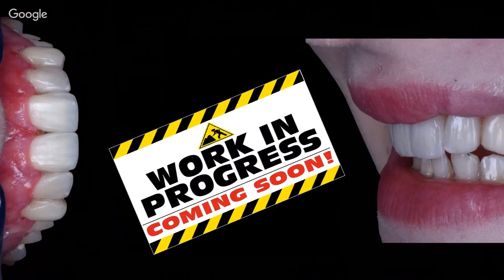For instance, right now I can see something that I would like to change. Thank God, just little stuff. But for instance, I'm going to change this embrasure, and as well I'm going to change this transitional line angle, and other little stuff. For instance, I'm going to ameliorate this white spot that I made with super color.